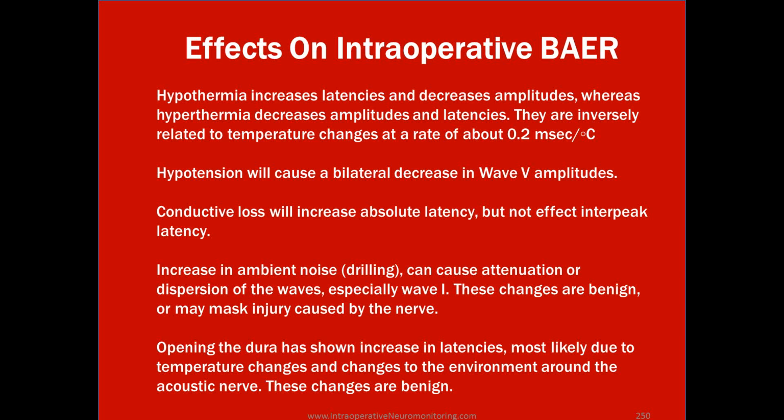This is the one that's most problematic, I'd say, because you've got your baselines, you're all ready to go. He opens up the dura, and then you have a latency shift happening at a very similar point in time when he's going to be putting the retractors in there to move the cerebellum. Just something you have to work around and make sure everyone's on the same page, and make sure that you have baselines that are representative at that point in the case.